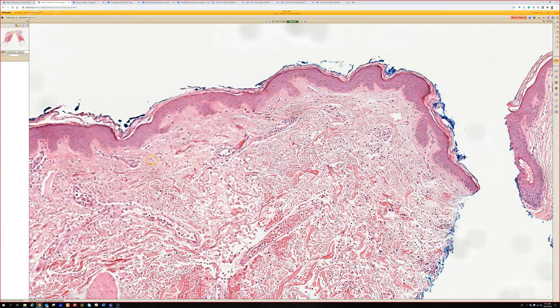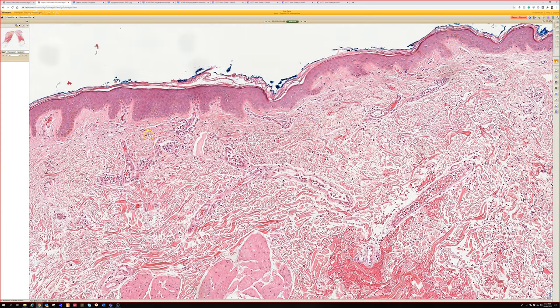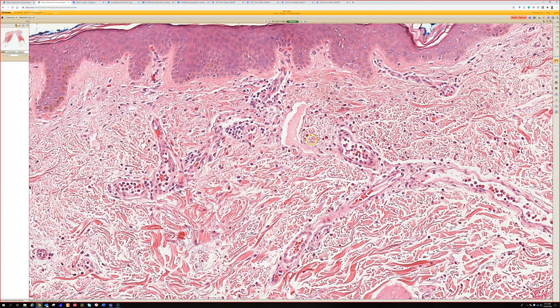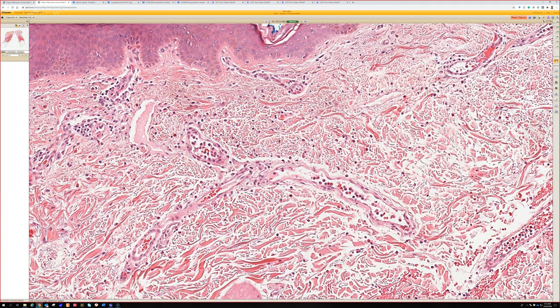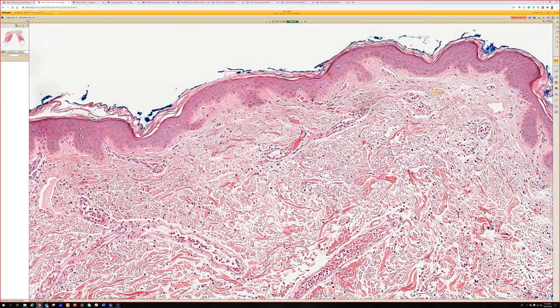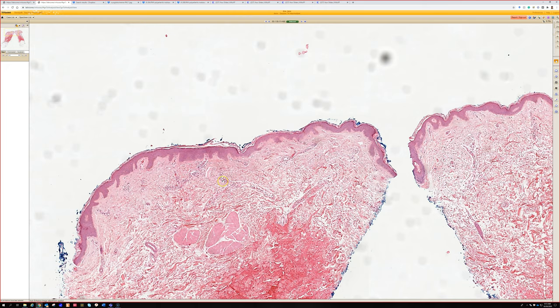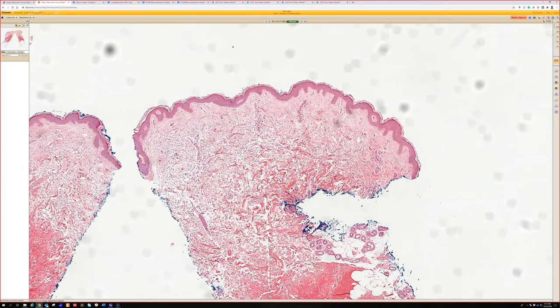This is a great example of urticaria. I would definitely agree — this is what I like to see for urticaria. I find the vessel dilation with the neutrophils really helpful. When you see neutrophils collecting in the vessel in these little small vessels superficially, I find that really helpful to support a diagnosis of urticaria. Then again scattered eos and maybe a few mast cells — not clustering, just scattered. Edema, sparse inflammation, neutrophils in the vessels and scattered in the dermis. That's a classic example of urticaria.